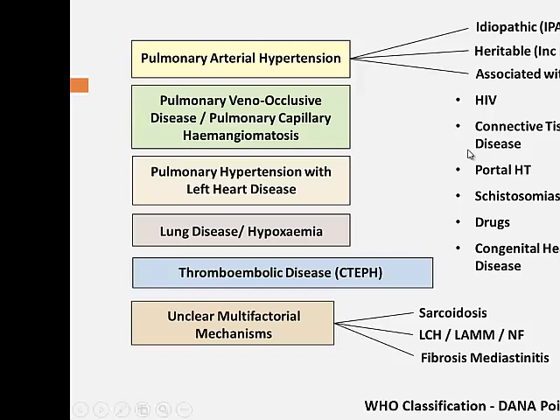You can see here pulmonary arterial hypertension is in this group by itself, and within that they include things like portal hypertension, where you get weird shunting, some drugs, and also idiopathic pulmonary arterial hypertension, which is what most people think of. There's also a group, the pulmonary veno-occlusive disease and pulmonary capillary hemangiomatosis. That's primarily going to be a radiological diagnosis, so I'll show you what you look for on CT for that.